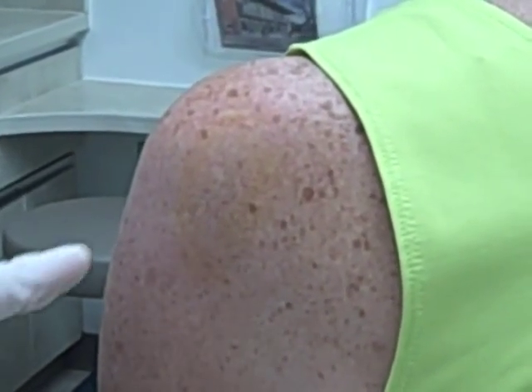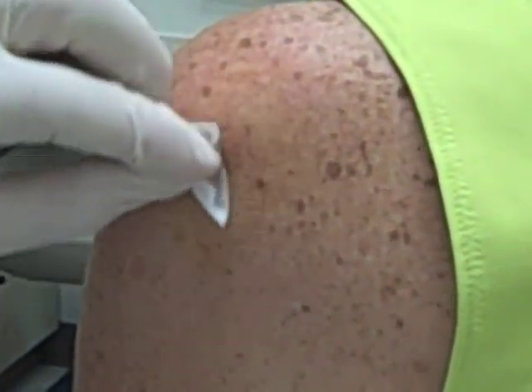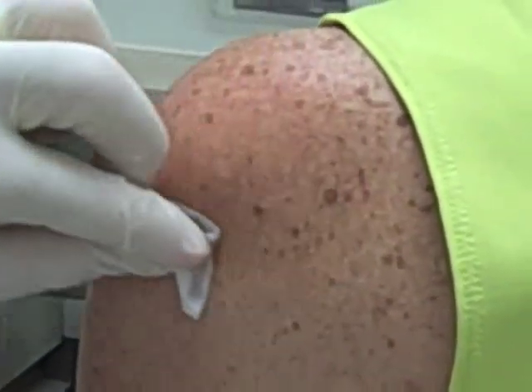We always mark the spot prior to prepping the skin and doing the injection. With the patient properly positioned and the injection location marked, the skin is prepped with betadine and alcohol using the no-touch technique.